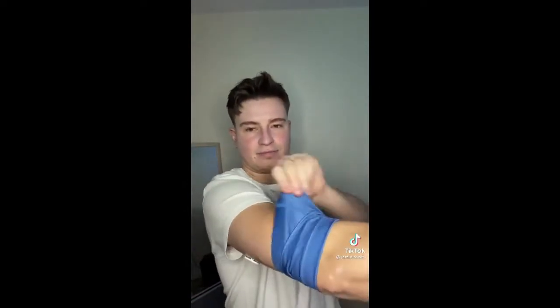So when Kyo Dyer reached out and said, we want to send you some alternatives, I said yes please. So here's me trying on the Dyerband.